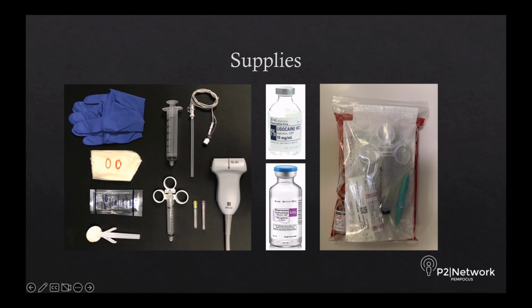You can also make use of an echogenic block needle shown here with a secondary syringe to have your anesthetic in it. Keep in mind that if you use the block needle, you need two providers. One provider will be holding the block needle as well as the ultrasound probe, while the second provider will be holding the syringe with your anesthetic and doing your actual injection.